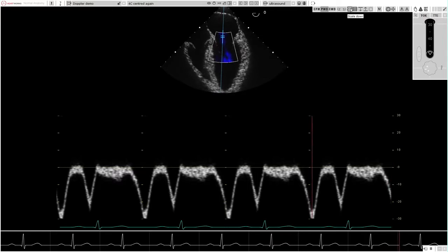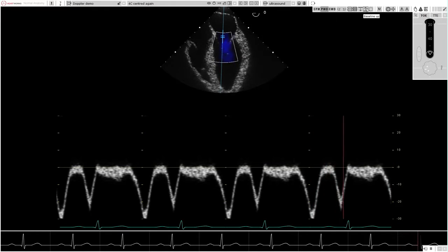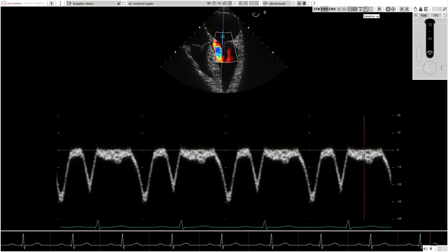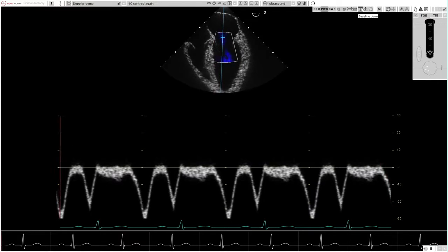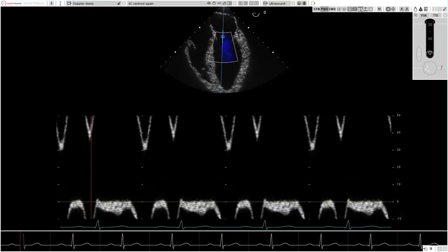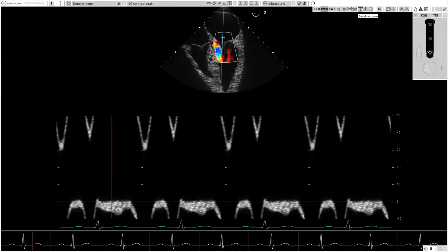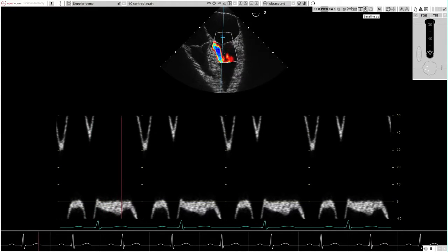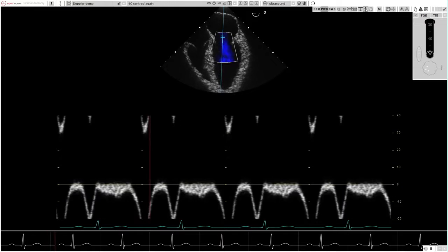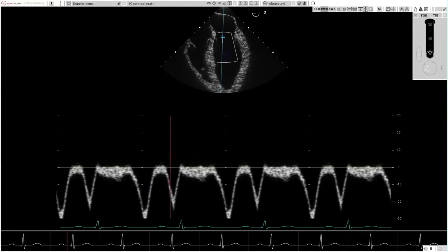The velocity scale and baseline position can be changed by the user to optimize the spectral display. Aliasing is displayed when Doppler settings are compatible with this phenomenon. Angle correction is also available.